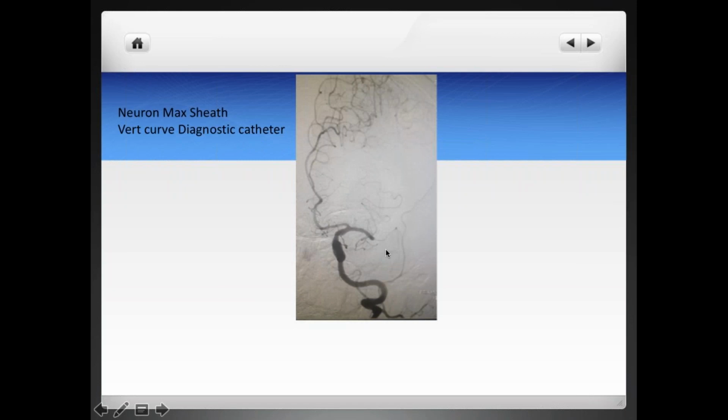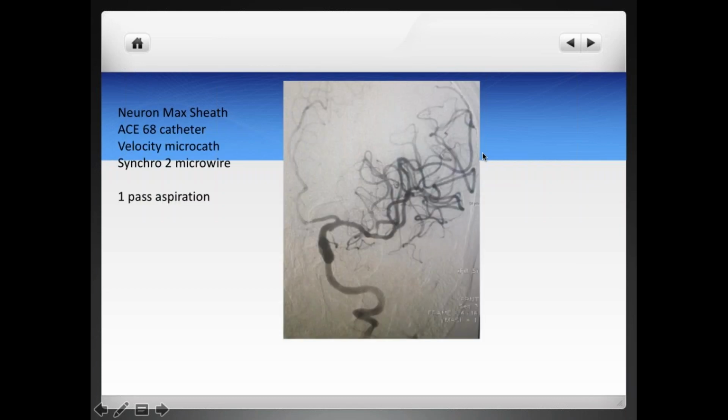middle cerebral artery. And this is the early arterial phase, so don't be shocked; you'll be saying by now, oh, but there are no collaterals right there, so this patient is going to do poorly. Well, it's the early arterial phase. My mistake that I didn't put any late arterial phase in this case, but the patient did actually have good collaterals in this case. And this is one pass of aspiration thrombectomy.